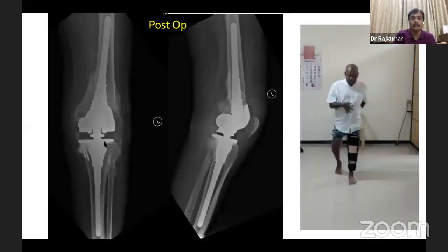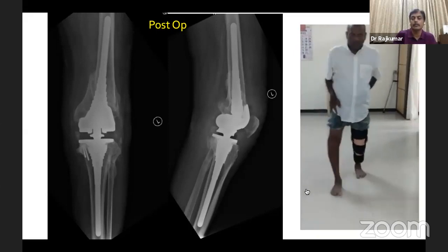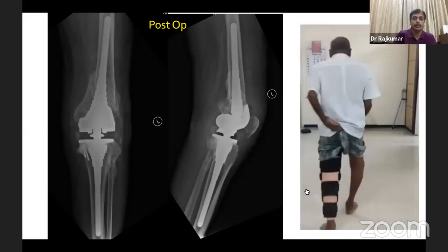This is the post-operative X-ray, and the patient after 2 weeks was able to walk. I used a hinge knee brace just for added support for 4 weeks. So this is the post-operative X-ray.